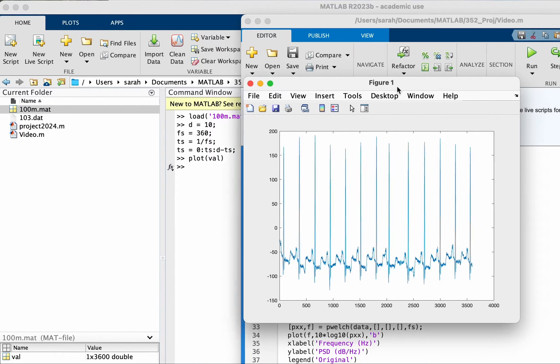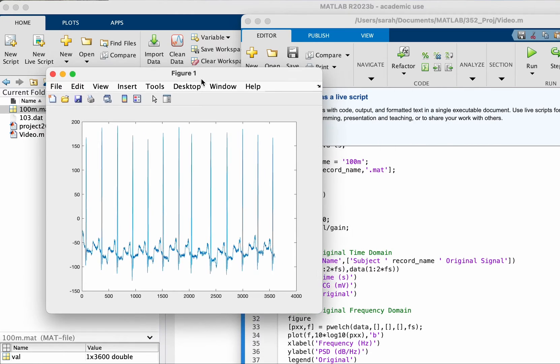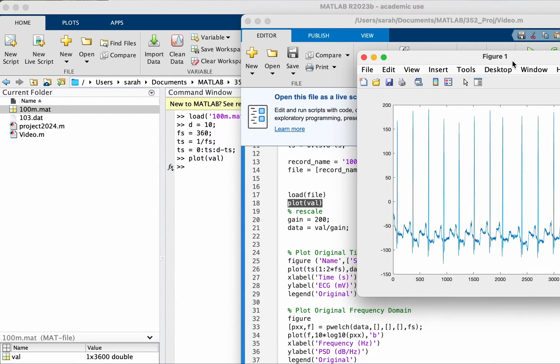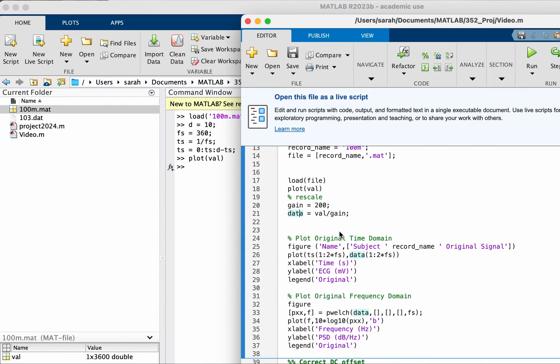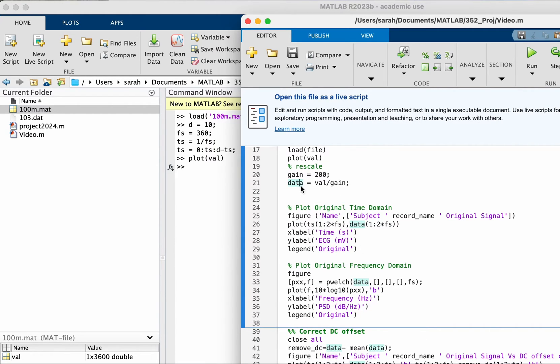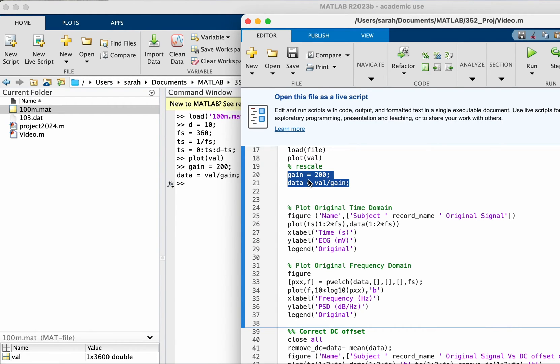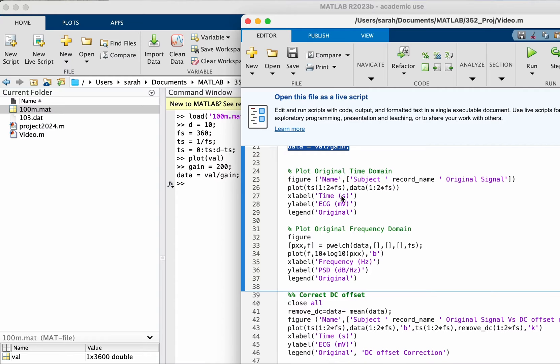In my case this signal was amplified 200 times, so I'm just going to scale my signal down by dividing over the gain. So now I'm scaling down the signal and then let's see how it looks.